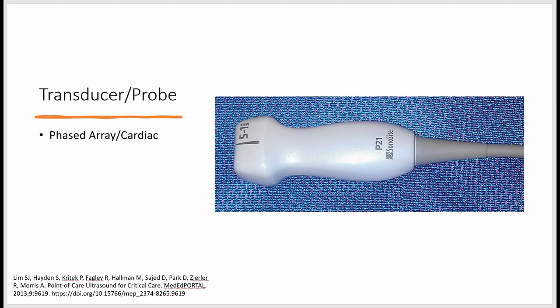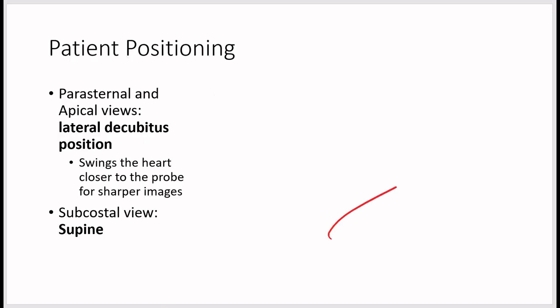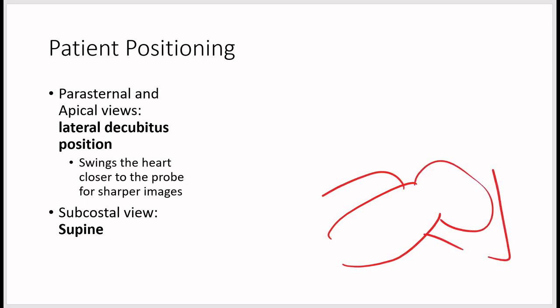The probe used is the phased array cardiac probe. We have the patient in the lateral decubitus position, which is best for parasternal and apical views, as this swings the heart closer to the probe for sharper images. For a subcostal view, the patient is in the supine position.